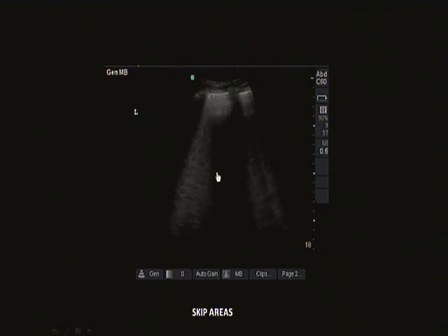The other thing that happens in ARDS is you have skip areas. We know this from CT imaging. So if you see B lines in one zone, and then A lines here, and then B lines in another zone, you start to worry that there's something that's not uniform, so either ARDS or a multifocal pneumonia. So that's something else that can be helpful.